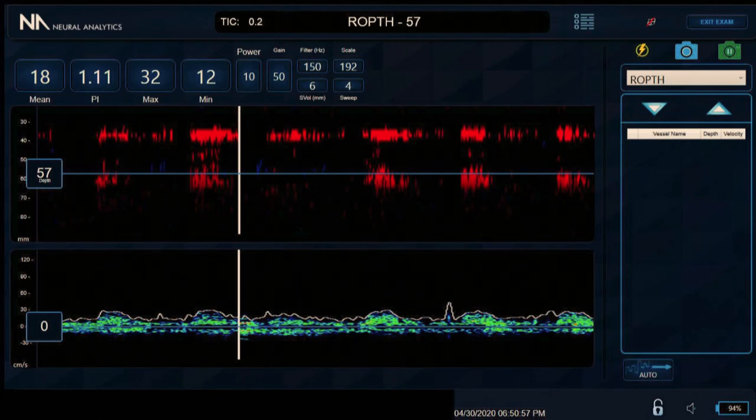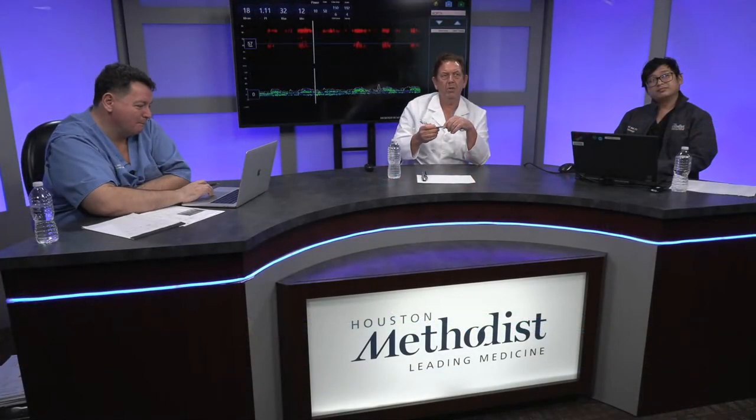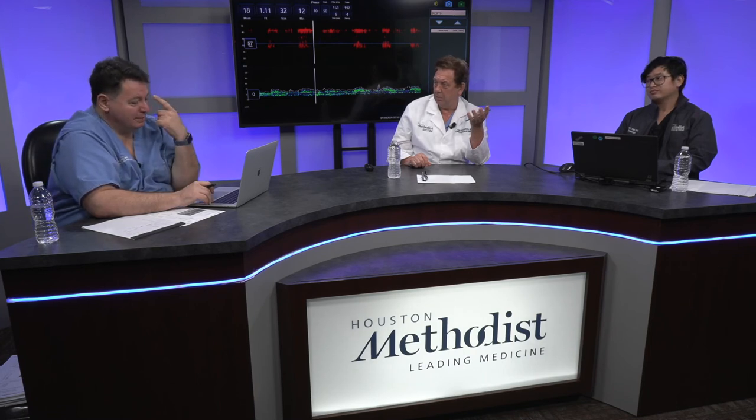Let me give them a little preface, because most people have probably never seen this before. Basically, with TCD you fire an ultrasound beam in through the temporal window and down the axis of the anterior cerebral artery and middle cerebral artery. The blue line that you see tells you the depth at which you're acquiring the Doppler signal. This should be 57 millimeters from the surface, which should be the middle cerebral artery. Yes, but this is the ophthalmic first.